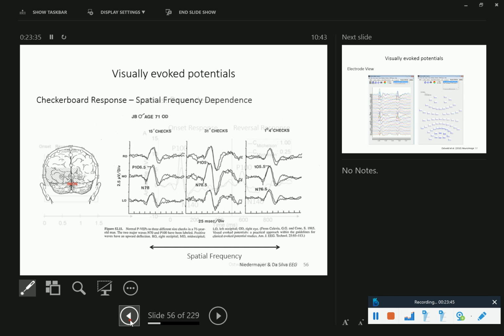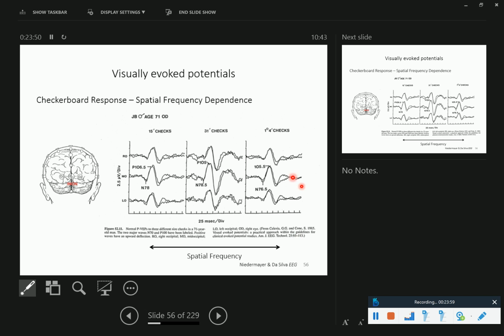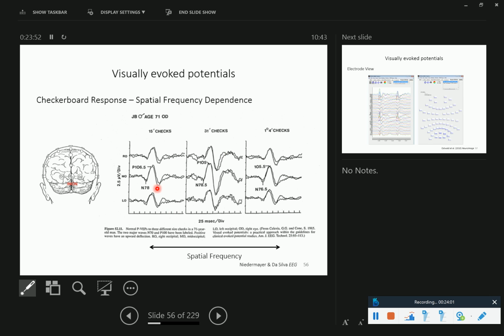So what I've shown you here and also on this slide are selected electrodes and maybe averages over some electrodes. So it's essentially not what I recommend to look at if you have just recorded event-related data. These are things that you find in papers or textbooks, because they are visually easy, essentially.